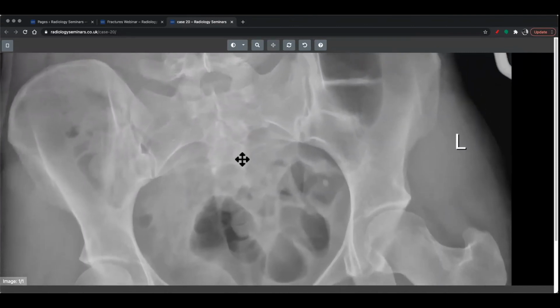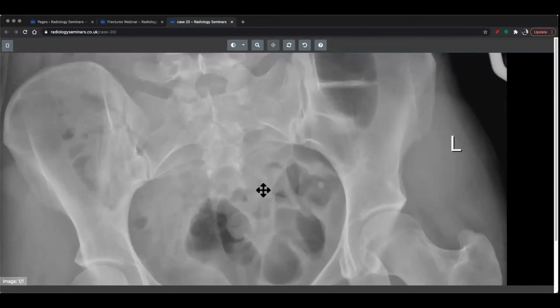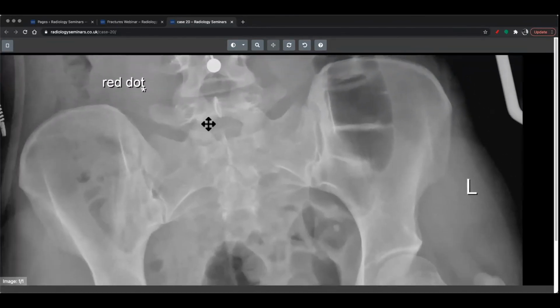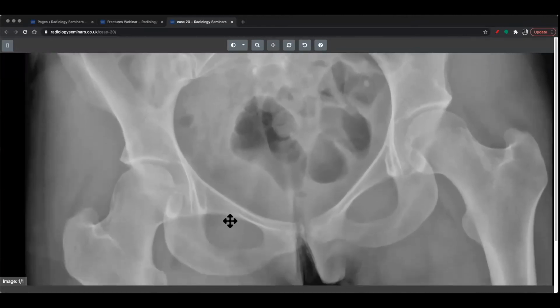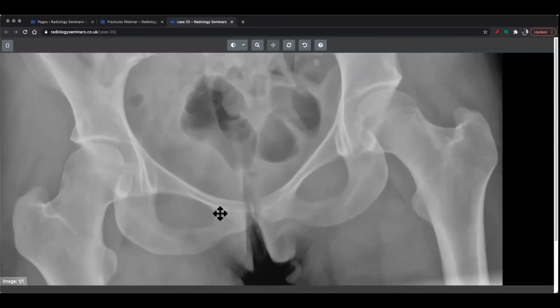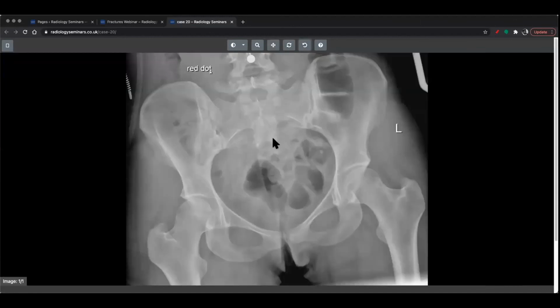A few answers, someone saying normal, not bad shout. I'm telling you they're in a lot of pain. So I'm going to say, look, mate, I'm not going to give you a normal one at the last one. So try and give me something, come on. Not long, 15 seconds to go. People are coming out with it. Good, well done. I should have gotten you something more challenging than these. Okay, good. 7 seconds to go. People are really throwing it. Good, well done. 4, 3, 2, 1. You lot, honestly, well done.